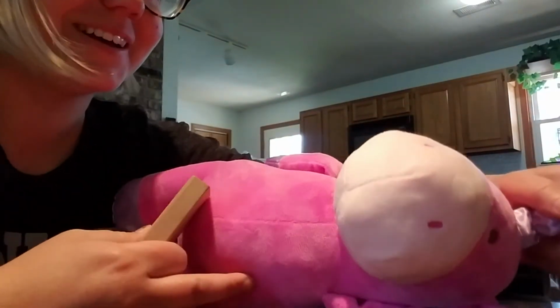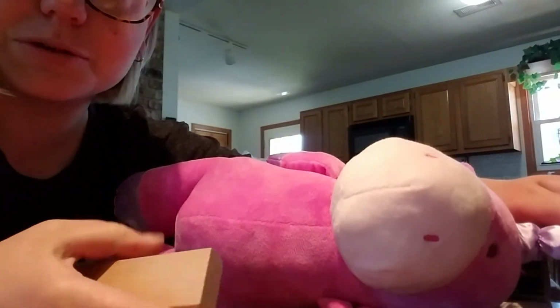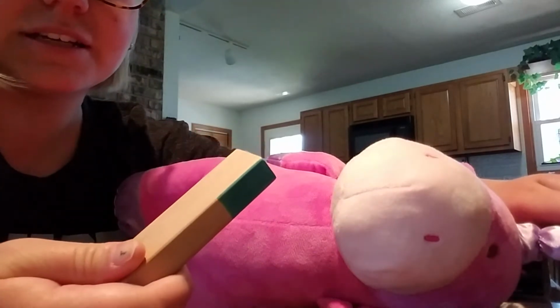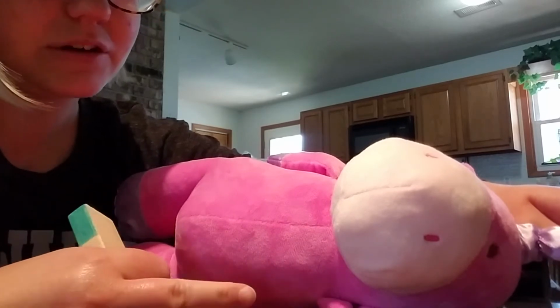This is Bethany Beasley doing the echocardiogram video submission protocol. I've got my block here and I've painted one side to show where the indicator would be, and my patient laying on their left side. I'm going to use this seam as my midline reference.